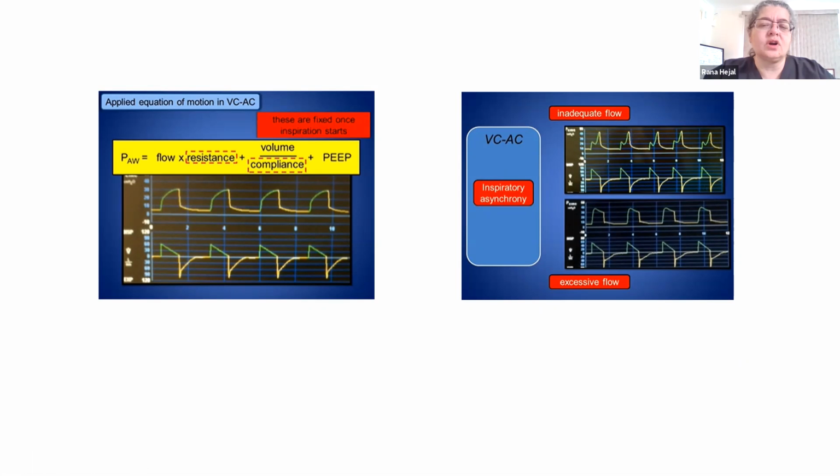And this is something that you commonly see in somebody with COPD if you set the flow very low. Remember, people who are obstructed are dependent on having a fast air flow, and as you have the fast flow, they have enough time to exhale.